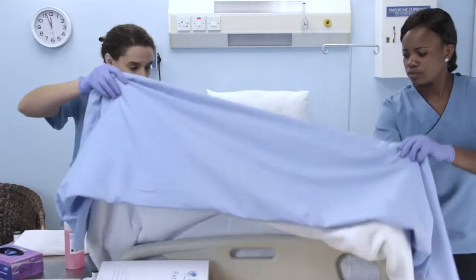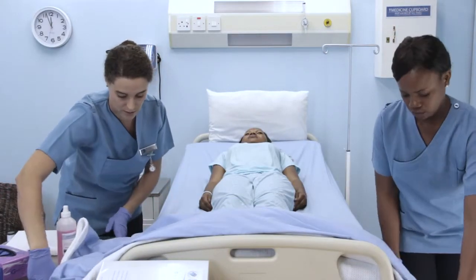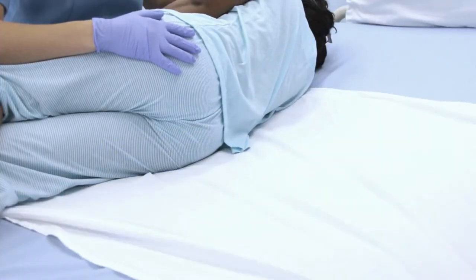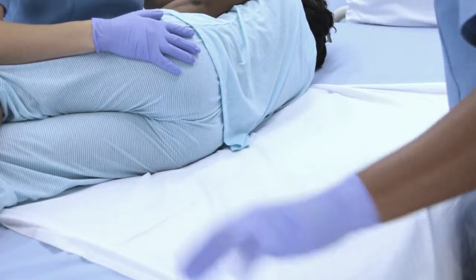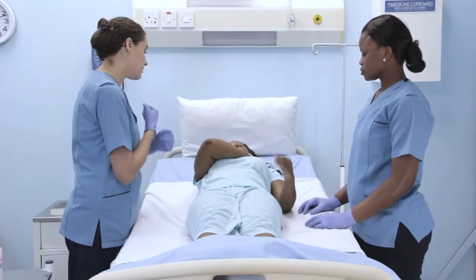Open the top linen by folding it to the foot end of the bed. If a draw sheet is not in place under the patient, place one under the patient's midsection. Ask the patient to fold their arms across their chest.